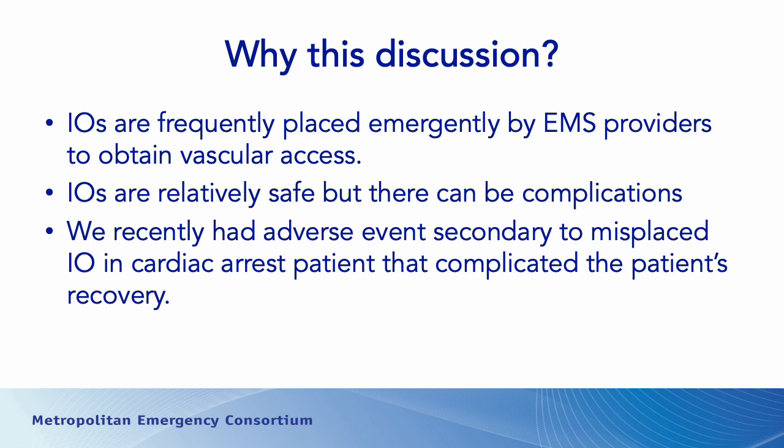IOs are frequently placed by us in order to emergently obtain IV access. They're relatively safe, but there can be complications, which is what's prompted this conversation today. We also recently had adverse events secondary to misplaced IO, in a patient in cardiac arrest, and the IO resulted in a direct complication of the patient's recovery, because the IO was misplaced as part of the cardiac resuscitation.